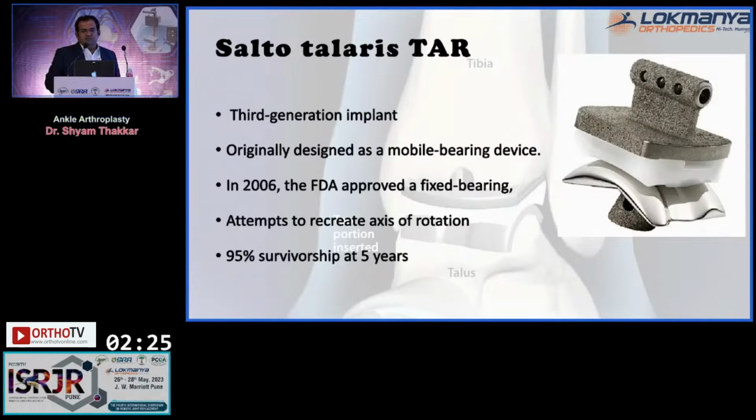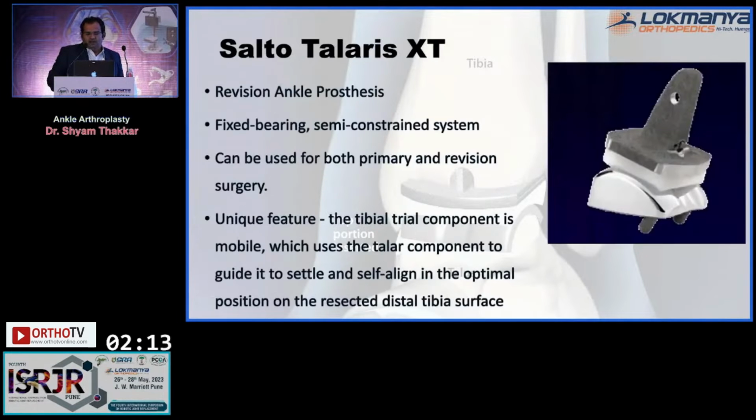So the peak forces are too much in the stance phase of the gait. So this was the original Salto Talaris, which is still there with some modified version. It's a 3rd generation, which was FDA approved in 2006, and which has overall 95% survivorship at 5 years. It also has a revision system, which is Salto Talaris XT, which has a unique component in which the tibial trial is mobile when placing the talar component. As we all see in TKR, the tibia is balanced as per the femur. Here, the tibia is balanced as per the talus.